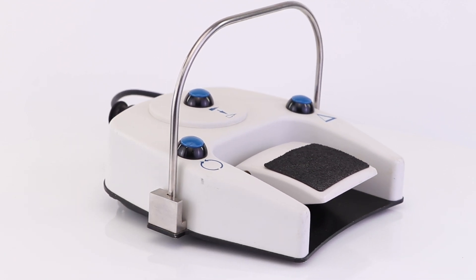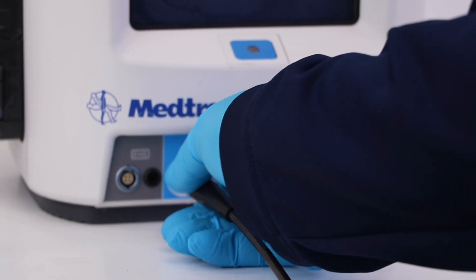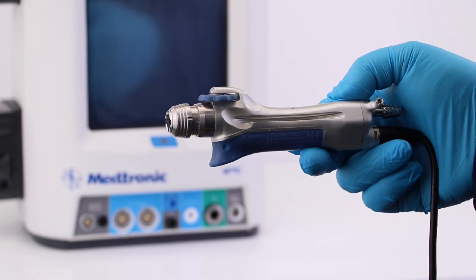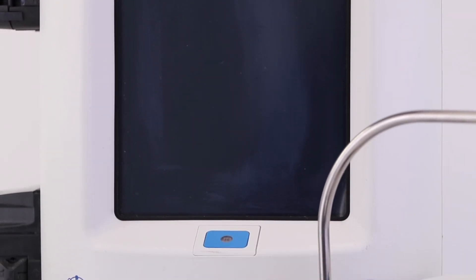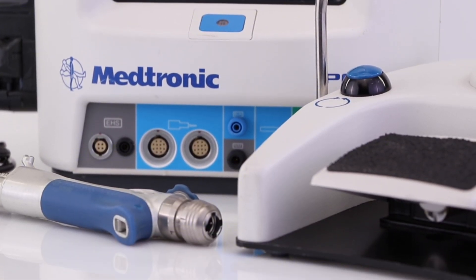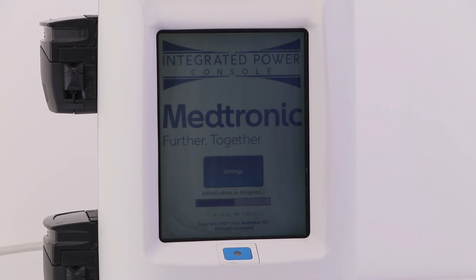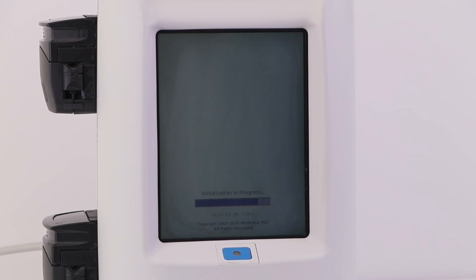Other benefits of the system include an IntelliFlow remote control for irrigation, 0.5 mL per minute irrigation flow rates for working in the facial recess, high-speed application-specific curved burrs for otologic procedures, a complete anterior skull base surgery solution, and an easy-to-use touchscreen menu for each handpiece.